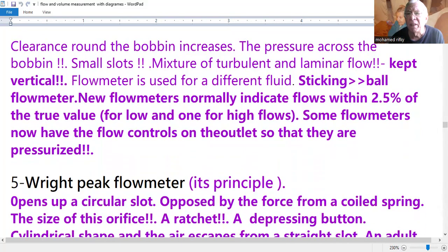Of course, the rotameter is liable to stick because the tube is not in a vertical position, or it may be affected by static electricity, or if it is at a very high volume or low volume, of course, it will stick. So there are many methods to avoid this static electricity. You could be asked.